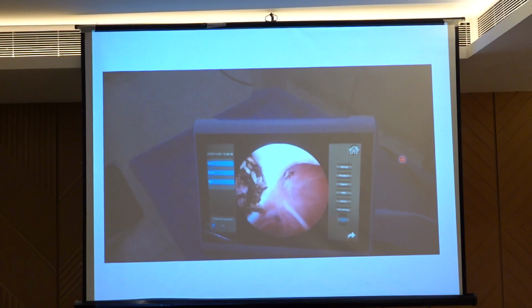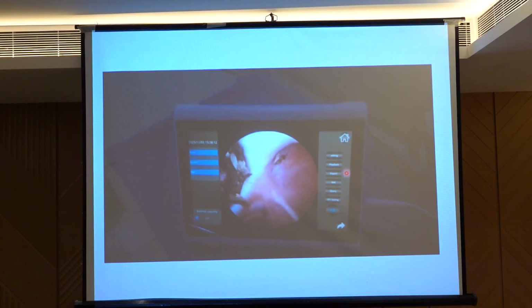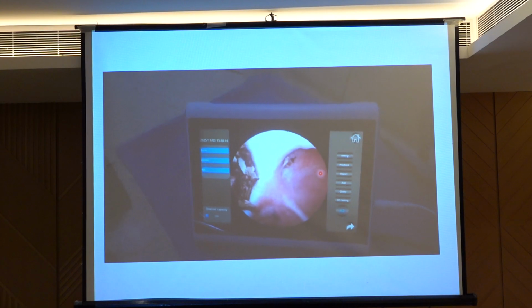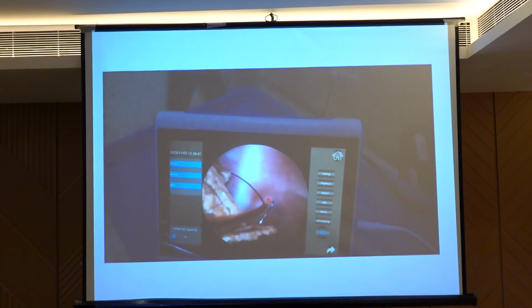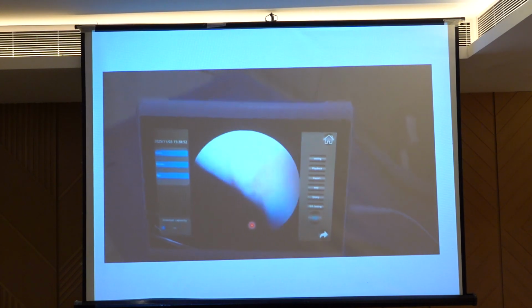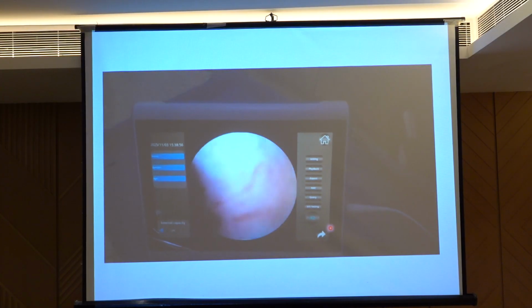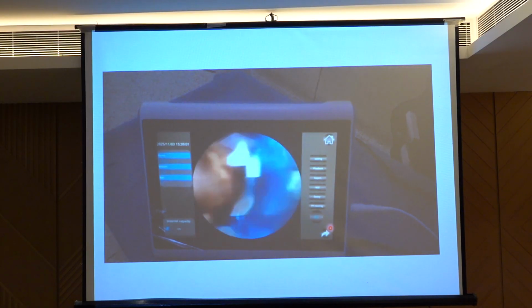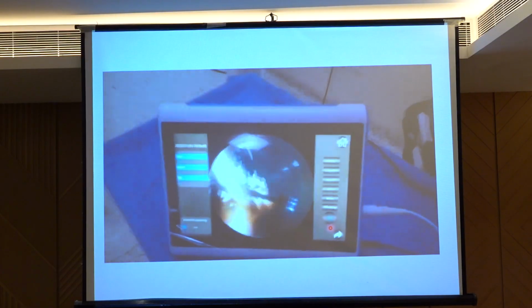This is to demonstrate that not all patients may even require the laser setting. This is one patient that we did recently who had very small 5-6 mm stones only, and he wanted clearance in the same setting. So what we did was we just grasped the stones using our scope and the basket, which is made of nitinol, and just by basketing we were able to retrieve all the stones in one setting. So we were able to provide him an incisionless, painless procedure without any complication for multiple small stones in this setting also.